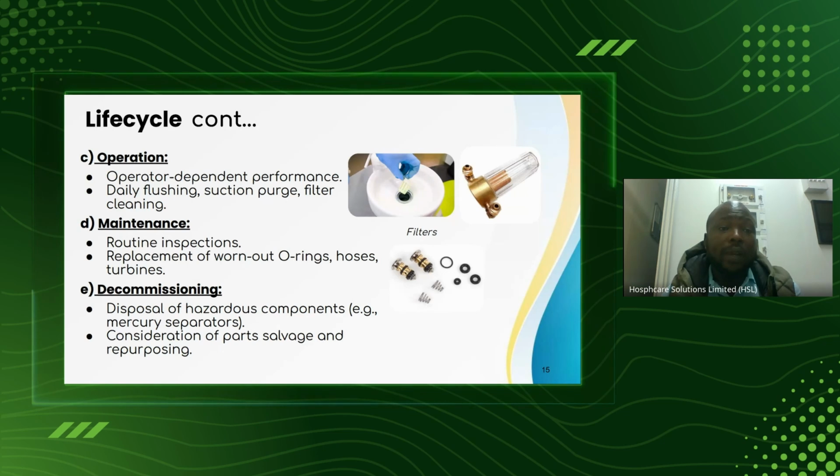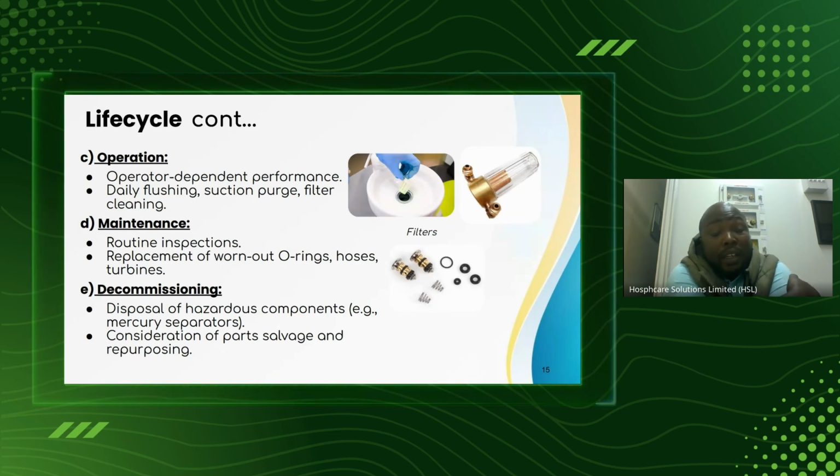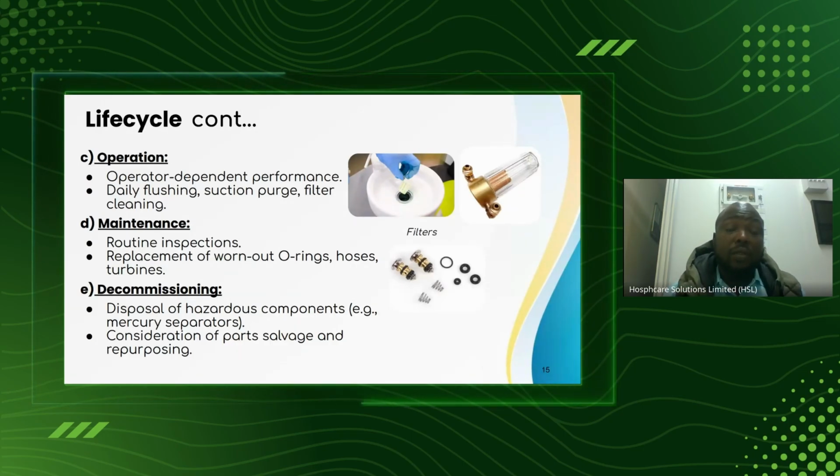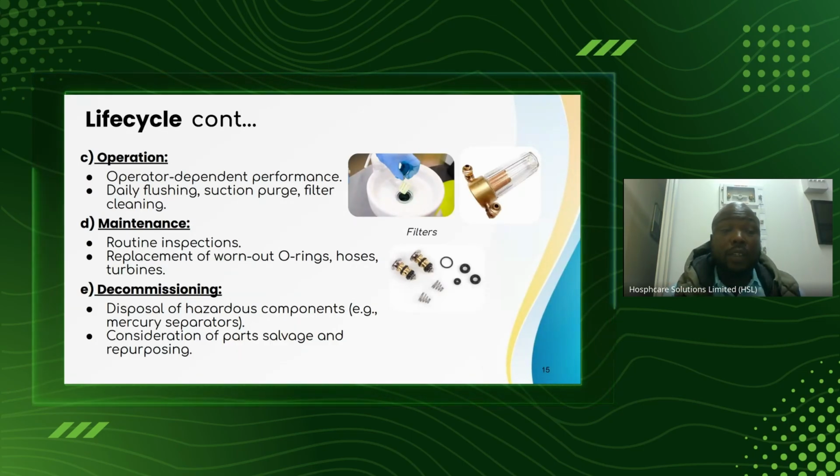Operator dependent: performance will depend on the technical know-how of the user. So once, as an engineer, you've done your installation, you need to provide technical know-how for the user so that the machine should be able to operate optimally.